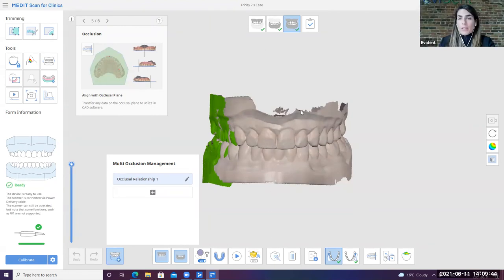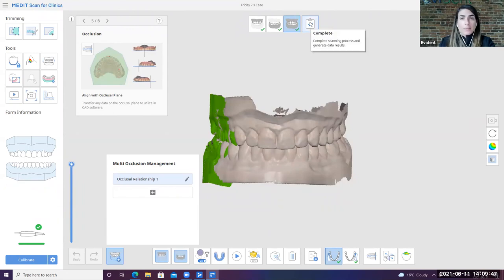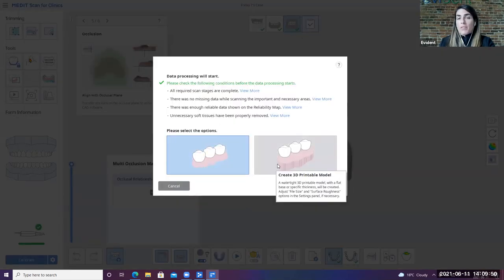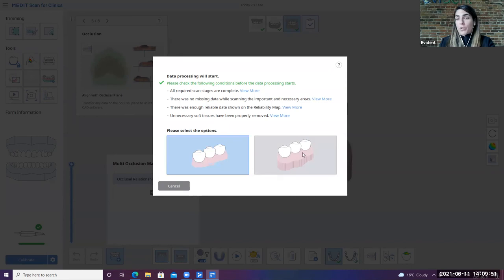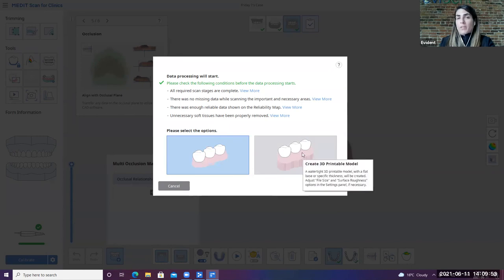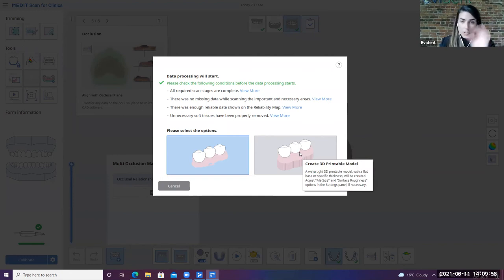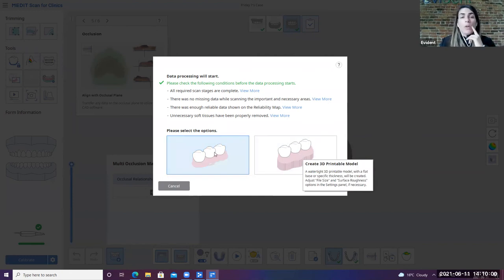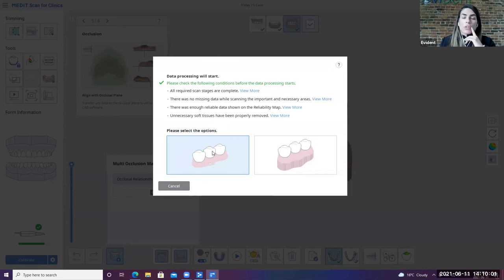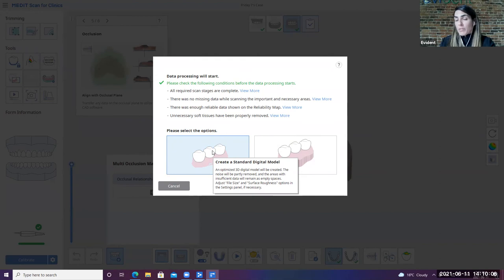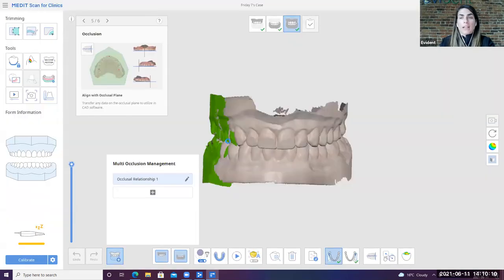Okay. So then now we've got this fit to go. I'm going to go ahead and complete our scan. So you have two different ways of exporting the files. You can export it to create a 3D printable model. So basically you can put a base of sorts onto your model so that it's ready for you to put them into your mesh mixer and into your printer and off you go, or you can do it as a standard digital model, which is the type of file that your lab will receive in order to be able to continue with the case. So that's what we're going to select.